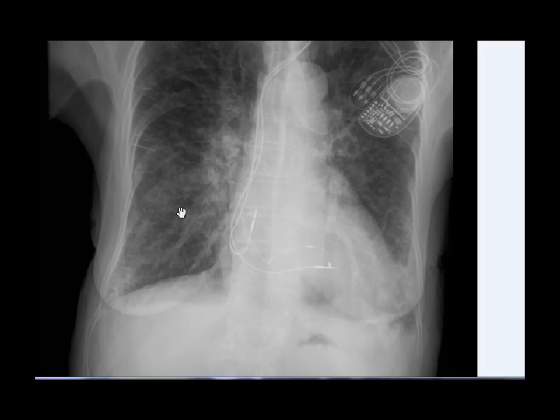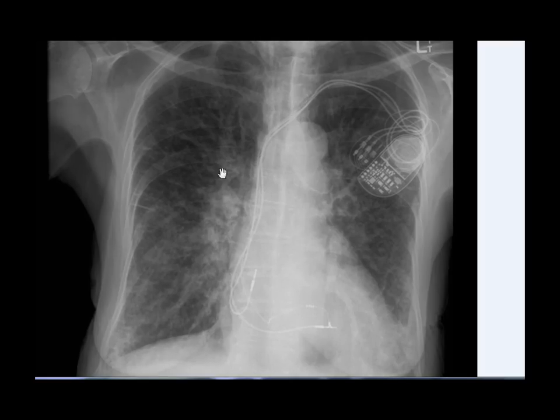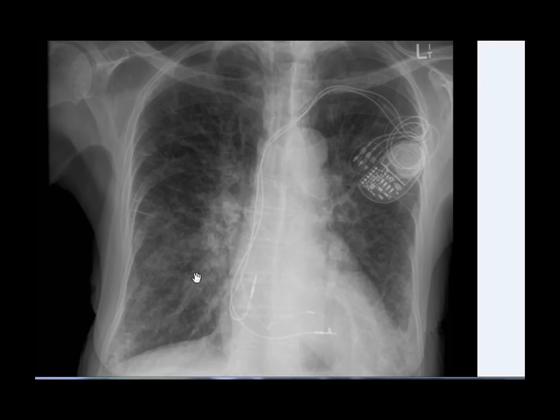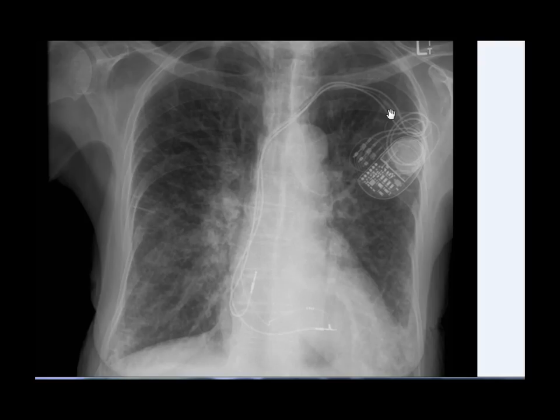Pleural effusion can be seen when lymphatics find it difficult to cope with the excess fluid coming into the interstitium as well as into the alveolar spaces. You can also see a pacemaker with pacing leads visible within the heart.